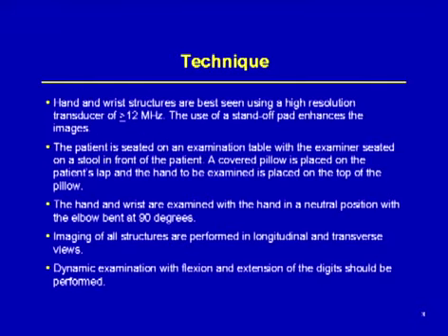For scanning the patient's hand and wrist, I like to have the patient seated on the table, and I like to use a high-frequency transducer of at least 12 megahertz. In some cases, you may use a standoff pad, which will enhance the images, particularly around the bony structures of the knuckles. The patient is seated with the elbow flexed 90 degrees, and I like to have the patient rest their hand on a small pillow that we can easily rotate from the palmar or the dorsal surface. Imaging structures should be obtained longitudinal and transverse for all views, and dynamic examinations help out, particularly with evaluating tendons from nerves and looking for other areas of pathology.